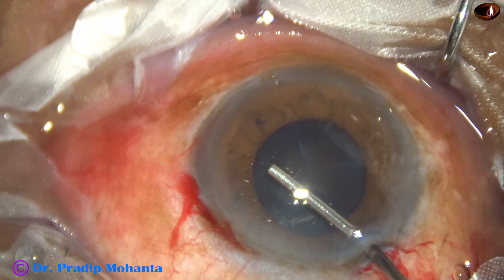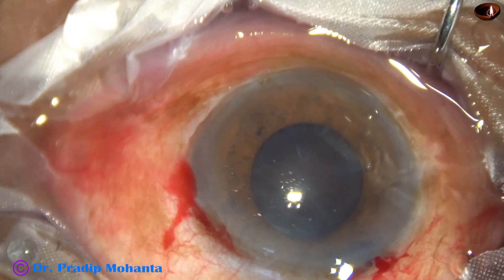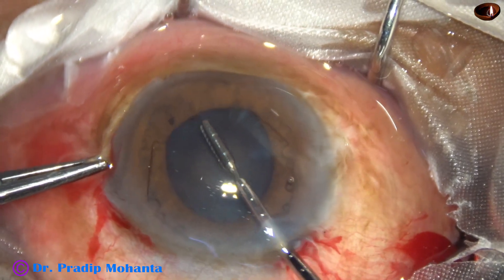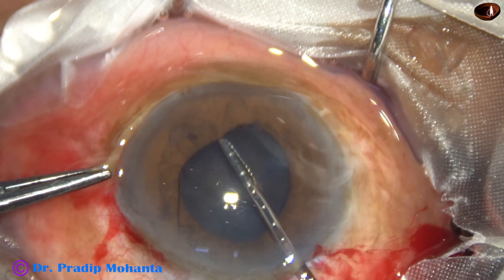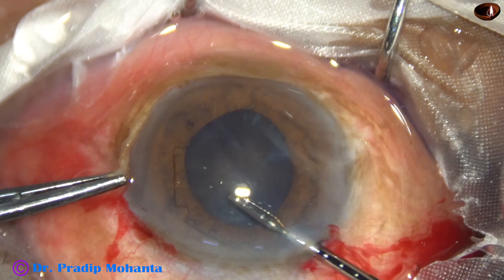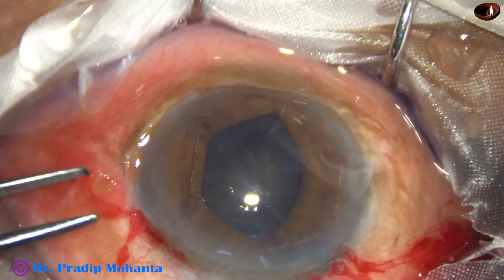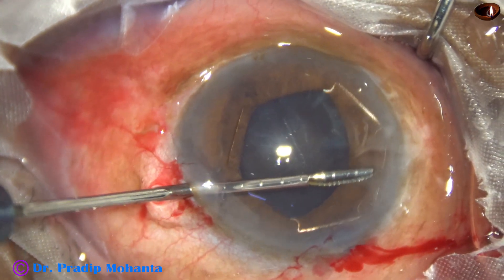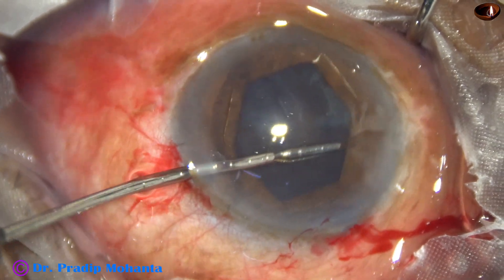A bit of visco is applied under the iris to make a little space so that the B-hex ring can be tucked easily. B-hex is a pupil expansion device invented by Convertachachi of Kolkata, India. The device is taken into the anterior chamber with the B-hex forceps. The leading flange is tucked at 6 o'clock as the hole of the ring goes into the anterior chamber. If the trailing end is stuck in the main wound, it is not forced. The left flange is tucked through the main wound itself, and the right flange directed at around 10 o'clock is tucked going through the left side port, and we get a beautiful hexagonal pupil.